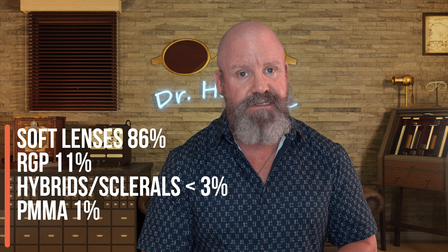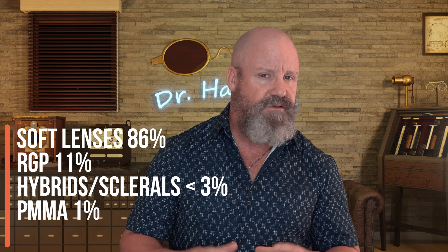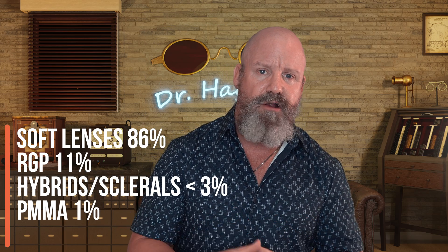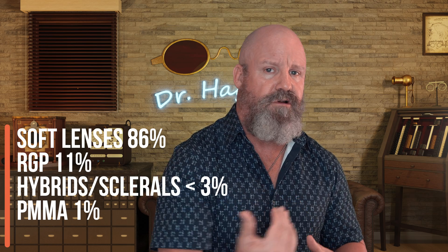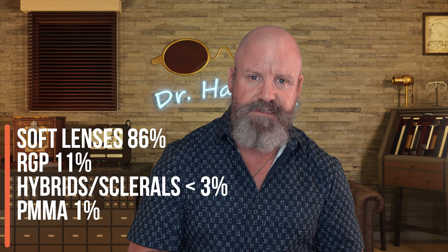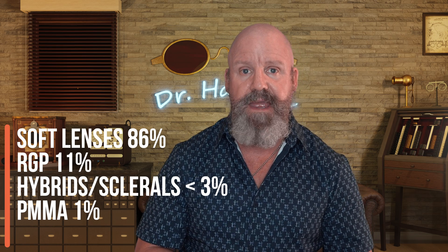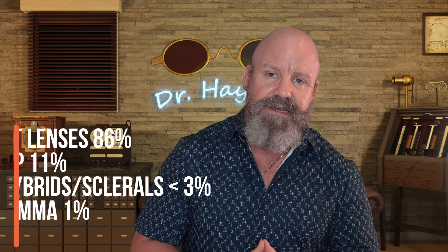RGP or gas permeable lenses make up about 11% of the market, which leaves just a little sliver of 3% for other things. There are hybrid lenses, which have a hard center and a soft skirt, used with people with certain corneal diseases. Some people still wear those old hard lenses called PMMA — polymethyl methacrylate — though I try to get those people out of those lenses because they just don't breathe well.